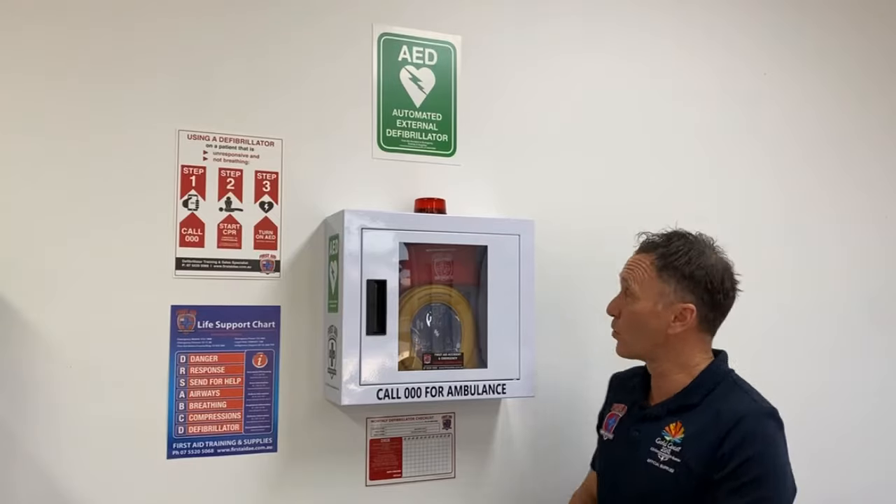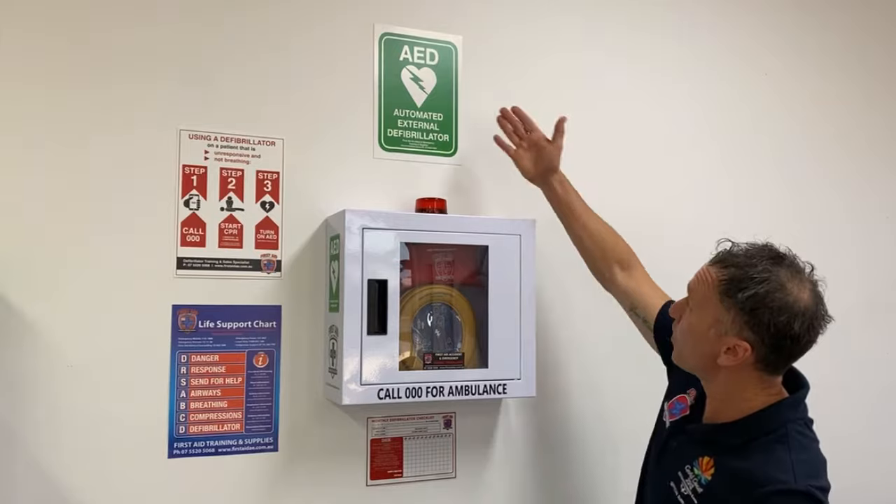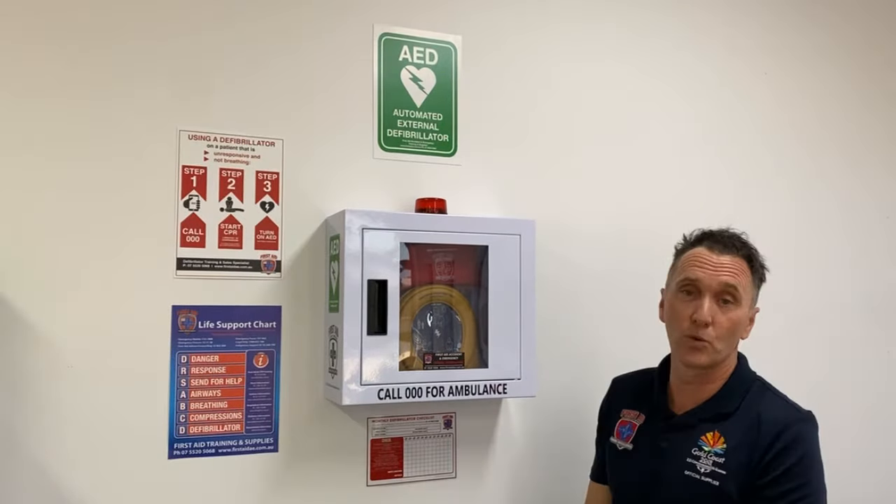Introducing the HeartSign 360p Wall Cabinet Bundle from First Aid Accident and Emergency, Australian defibrillator supplier to the Commonwealth Games and Park Run Australia. So what do you get in this particular bundle package? Well, as you can see, number one we have the AED wall sign making it very visible within the workplace.